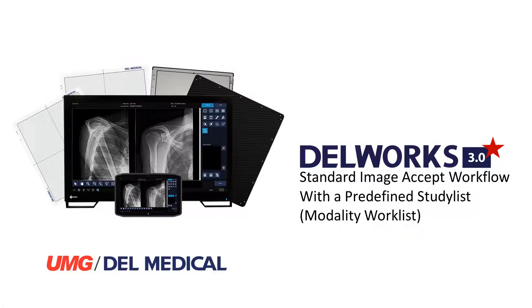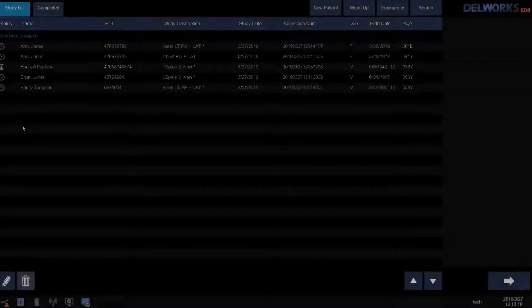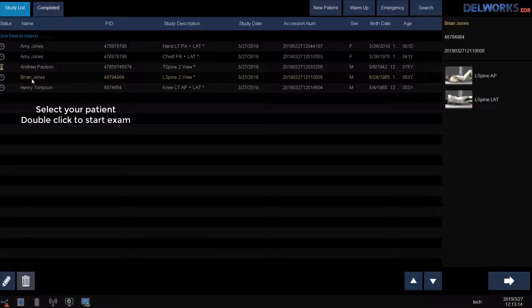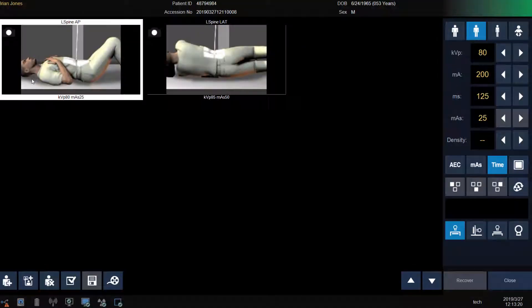First, I will describe how to start a patient if you have a modality worklist or predefined study list. If your facility has modality worklist and the application specialist has mapped the exams to your procedure codes, all you have to do is double click on the patient's name to start the exam.